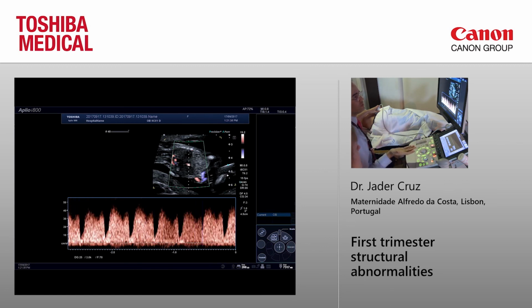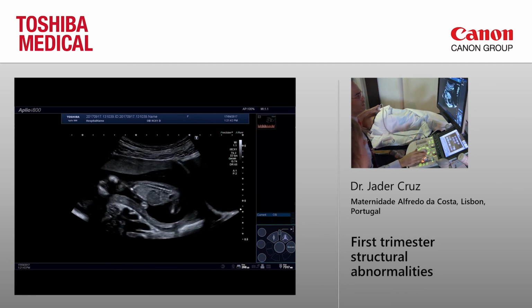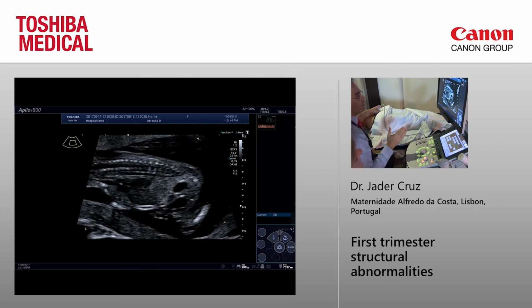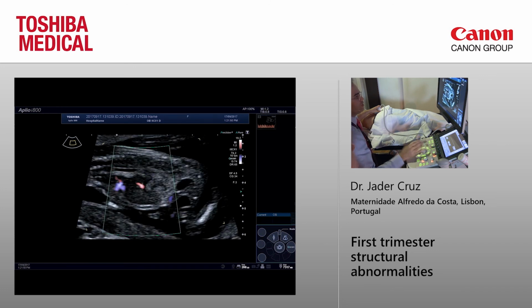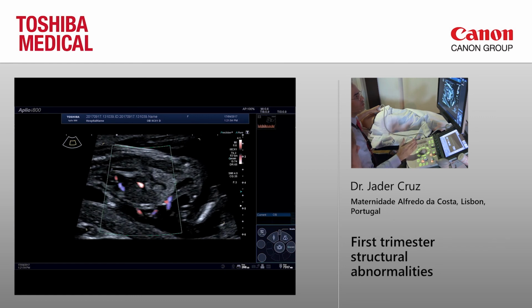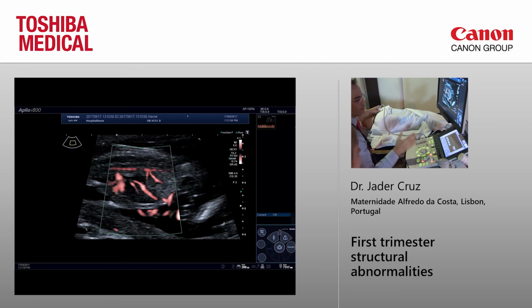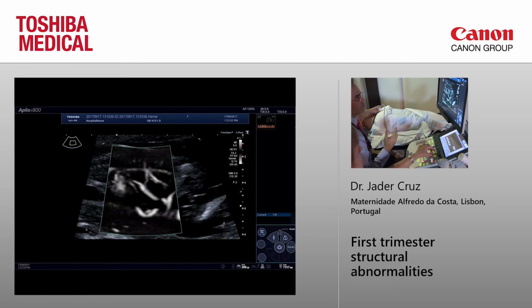Yep, you can do ductus venosus in either position, with the baby facing up or the baby facing down. You should have a proper sagittal view of the baby, good magnification, and then place the color. I'm using here the ADF, high definition color. You can use SMI, color SMI, or if you like, you can use this nice color, this nice SMI.